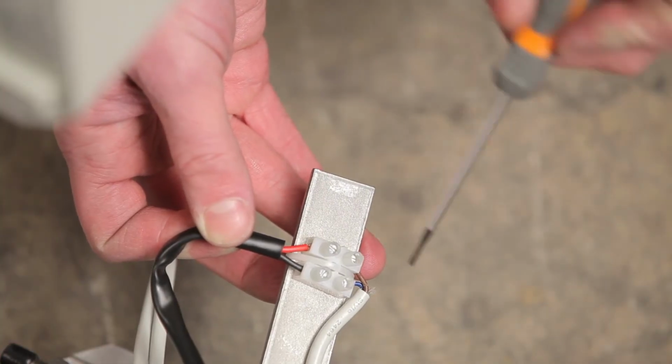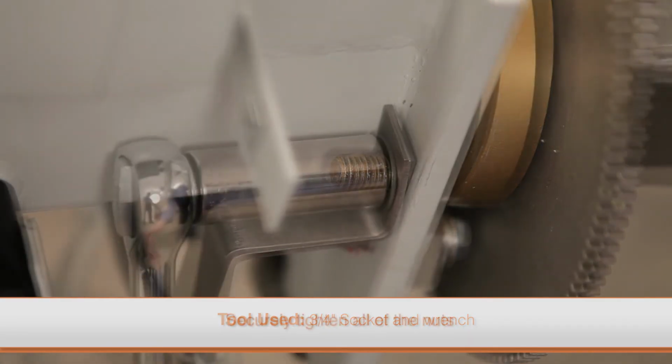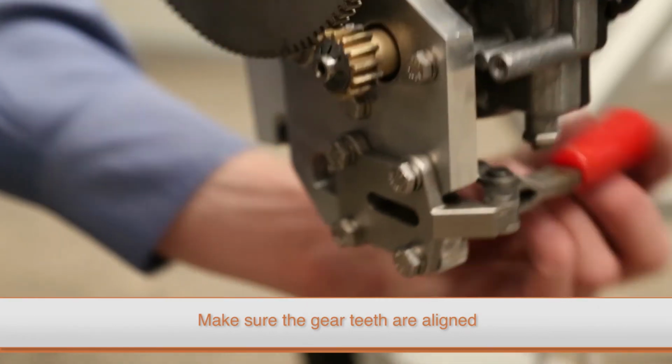Correctly connect the motor cable and motor cord to the terminal block. Reinstall the support bracket and install and securely tighten both nuts. Reattach the small gear, engage the toggle clamp, and make sure the gears mesh without binding.